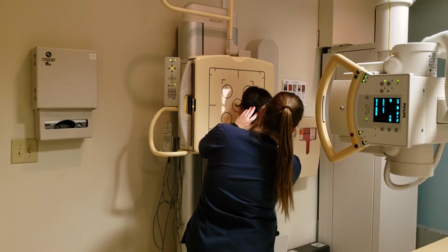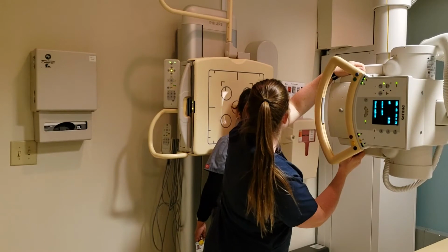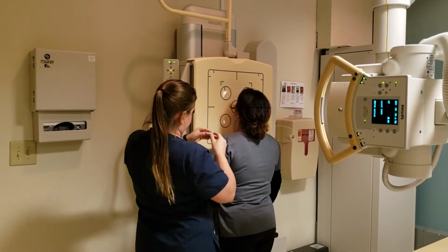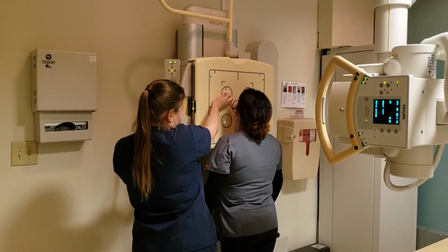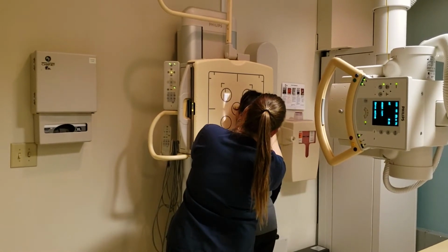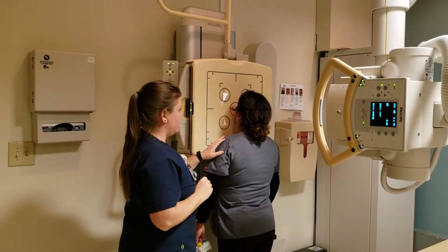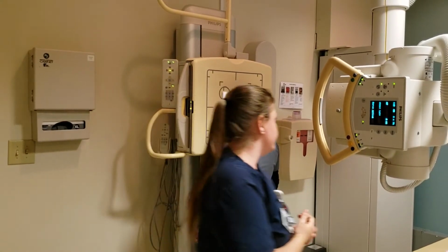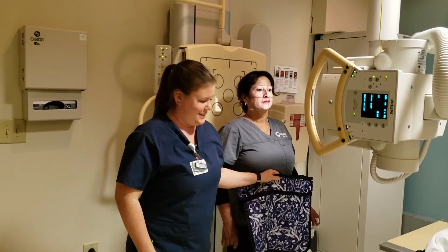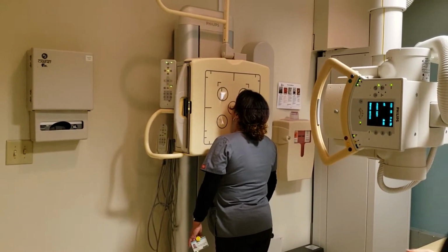And I'm going to have right there. I have my left marker back here. Alright. This way. Perfect. And for this one, I'll do 75 at 20. Throughout all of them, she's been wearing this shield. So the same thing, have her hold her breath, x-ray, you can breathe.